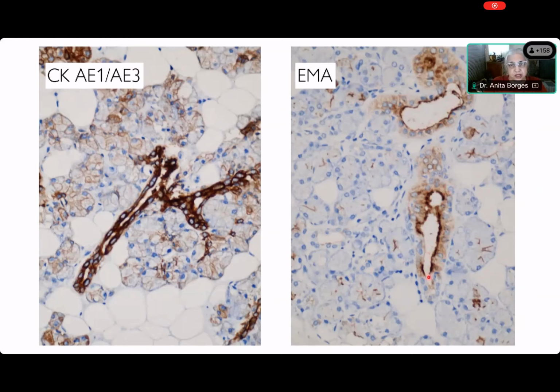Now you tell me. He said that the epithelial cells of the ducts are expressing cytokeratin. What about the acini? Soumik, you can see the acini? Yes, madam. All right. You want to show everybody what is acini? Ask for annotation, Soumik. You know how to do it? There is a little squiggle on the side. All right, I think it's going to take too long. These are acini, and you can see them where my cursor is.